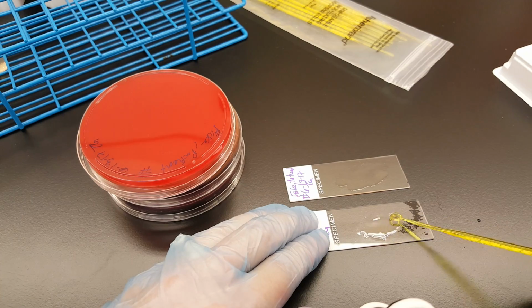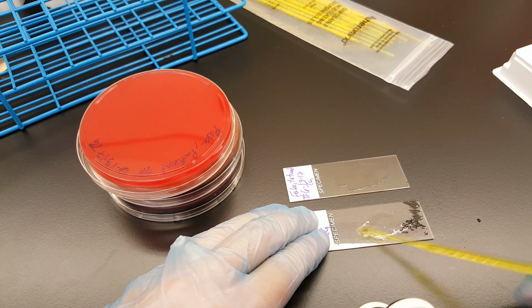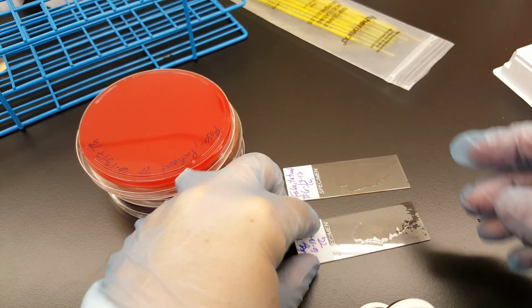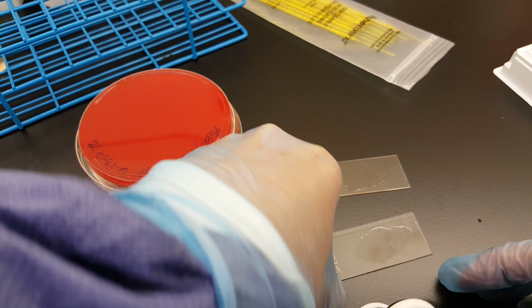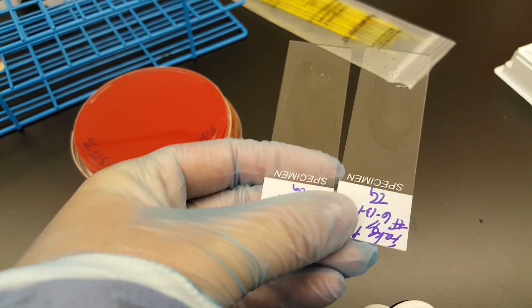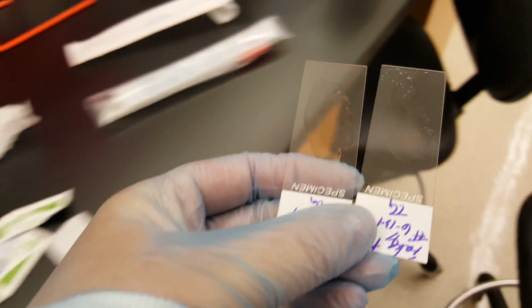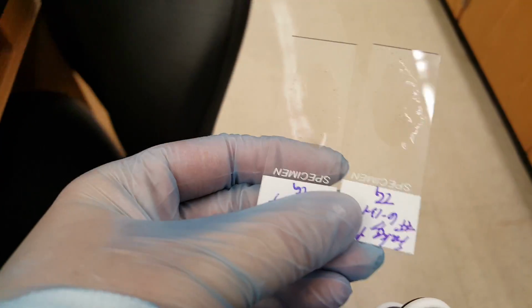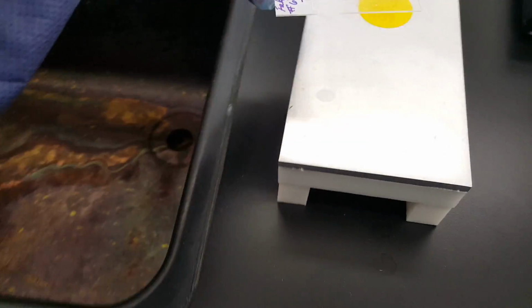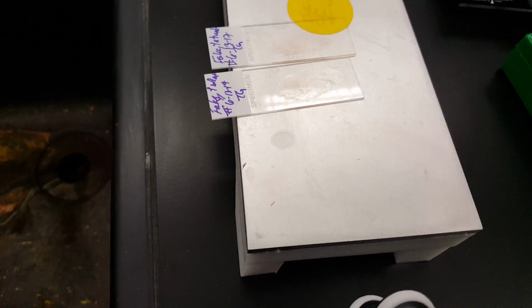Make sure you keep away from the edges, because you want to try to keep this as sterile as possible in regard to not spreading infectious disease. So anybody coming behind you, if they had picked them up, you don't want them to possibly transfer any infectious disease from that blood to someone else.